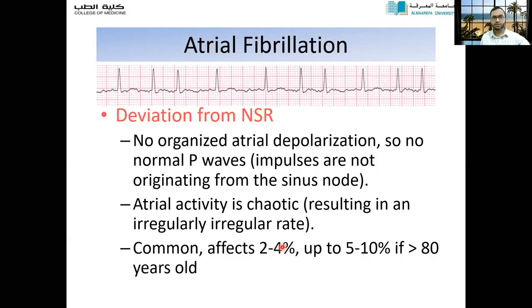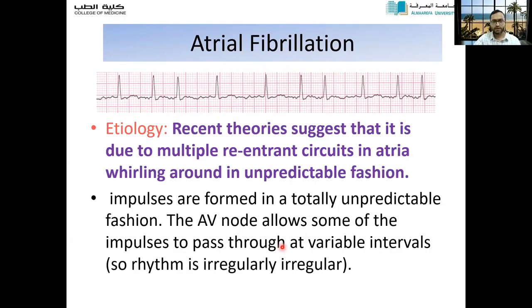So this is, in short, what we have seen about how to read the rhythm and how to utilize our knowledge of reading rhythm in some of the arrhythmias. And definitely, I have not covered all the arrhythmias. I have just given an example of some of the sinus and some of the non-sinus arrhythmias. In future, when time permits, we'll go for a separate lecture for higher-level topics in arrhythmias and all those things.